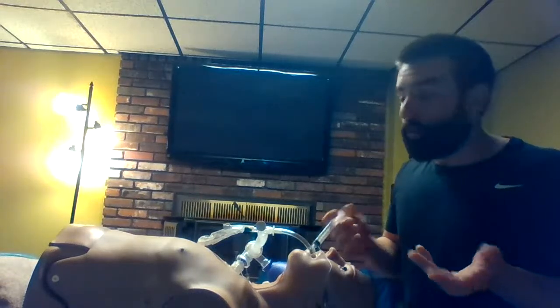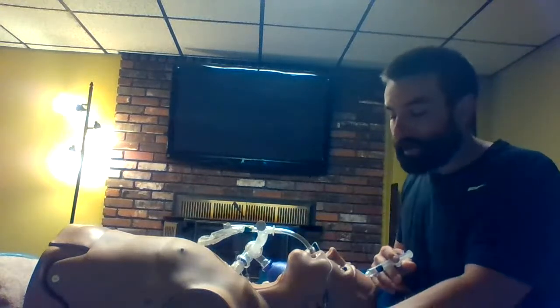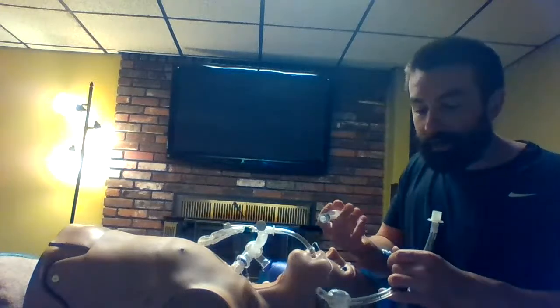So it's tough. How do you know what's what? We know that by placing air inside of the cuff, it did not fix our leak. There'd be a lot of other stuff going on right here, right now. I'd be manually ventilating, not talking you guys through all this stuff. So let me show you something that kind of works for me, and I've kind of found.